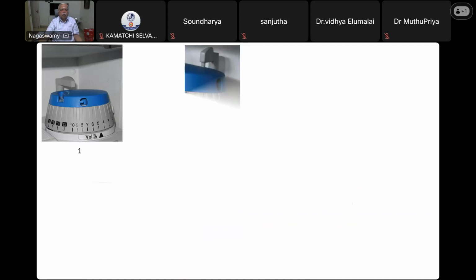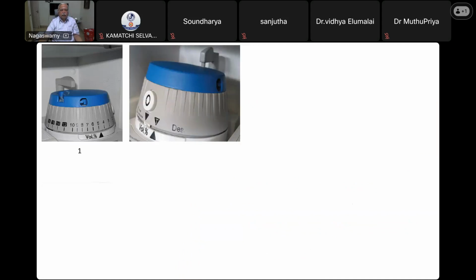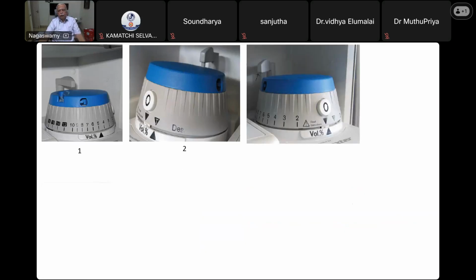So I'm showing the dial. Which vaporizer dial am I showing here? 1, 2, 3. Desflurane. Desflurane vaporizer.